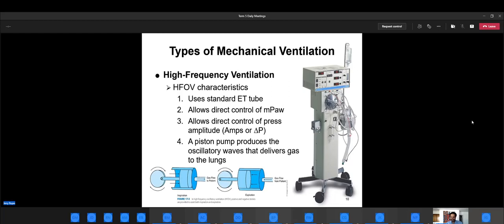So that doesn't change. Even though the end of this tube doesn't look like it, with a little green stopper there, it will fit a standard ET tube adapter with no problem.